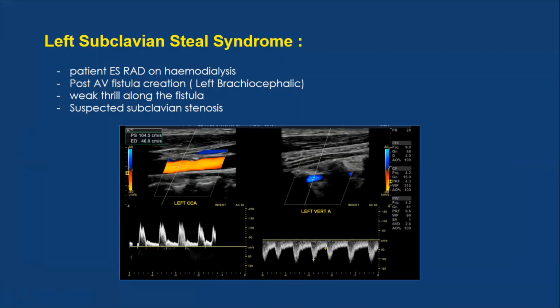Actually, the sonographer picked up slow, damped, low velocity flow in the brachial artery, and this is subclavian. So he went more proximally, starting with checking the vertebral artery and common carotid artery. So we can see here that he interrogated the left common carotid artery, so all the things are on his left side. And as per the direction, we can see the color steering. It's here.